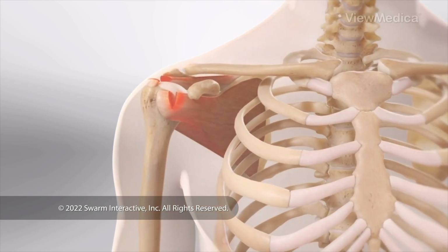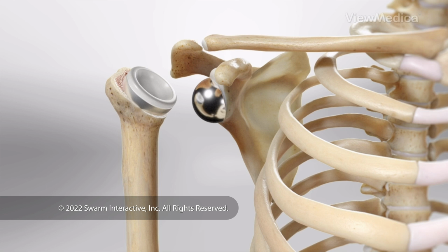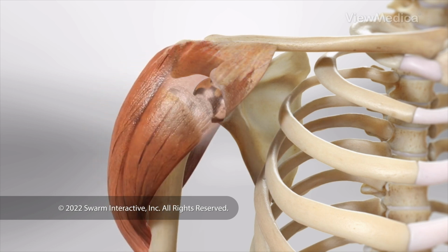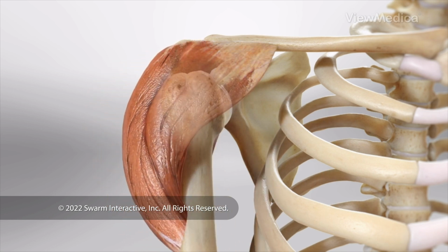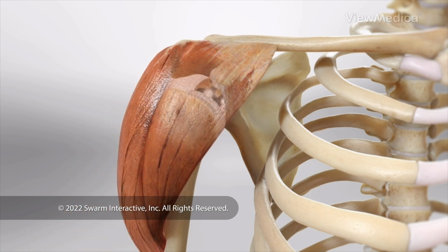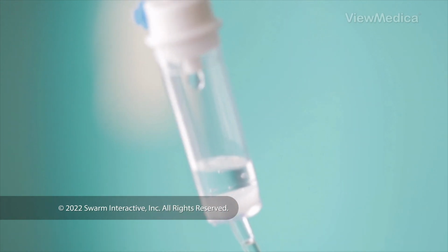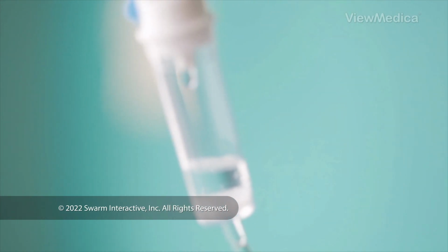This surgery repairs a damaged shoulder joint. It reverses the position of the ball and the socket. This lets you move your arm with your deltoid muscle instead of the muscles of the rotator cuff. To begin, you're put to sleep, or you're given medicine to make you feel relaxed and numb.